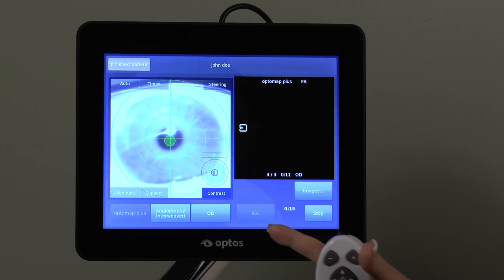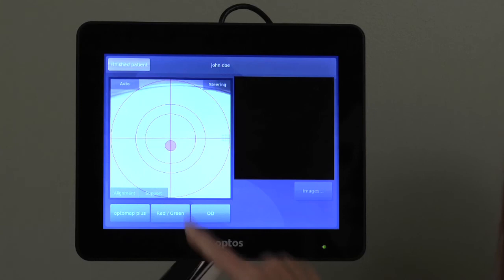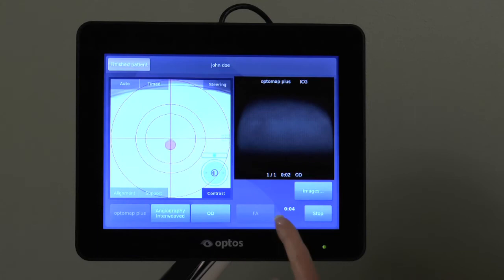When the study is complete, select Stop and confirm by pressing the Stop FA and ICG button. You may begin a simultaneous FA and ICG study by selecting the Angiography Interweaved procedure to start, which will allow you to capture alternating FA and ICG images.